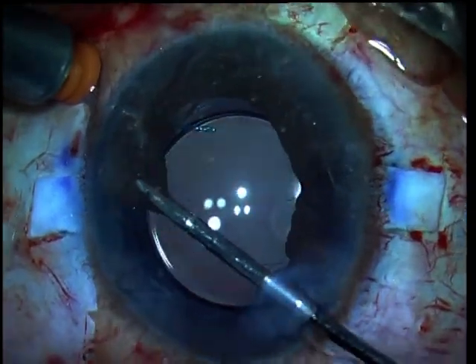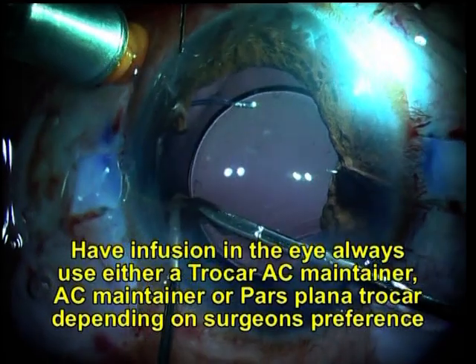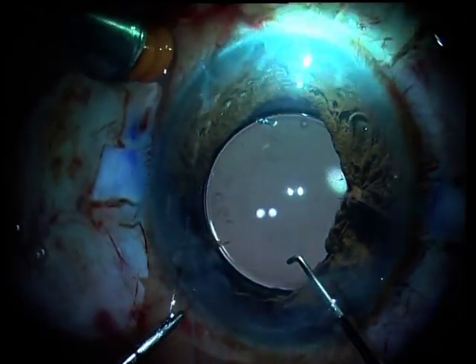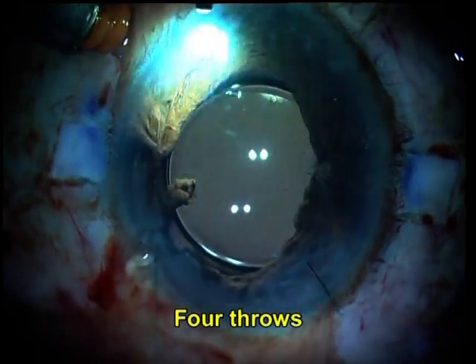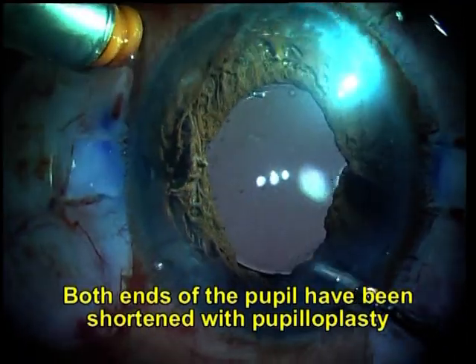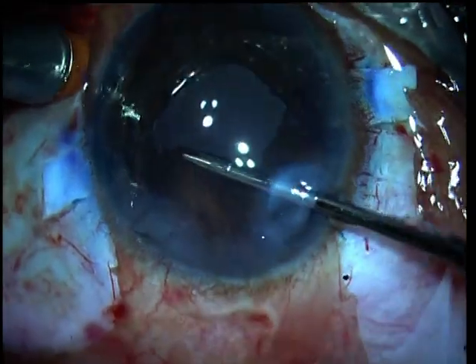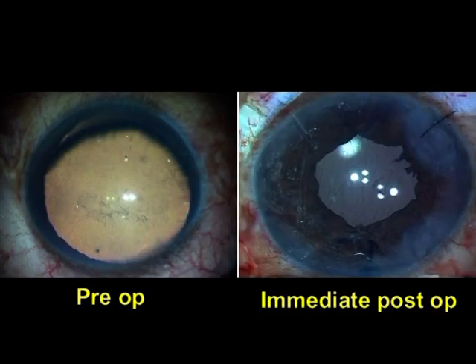The same thing is going to be done on the other end. You will notice we are using an endo-illuminator all the time for visualization. From the other end also, a loop is created, then 4 throws made, and the two ends of the suture pulled. Once you have got the pupilloplasty done, you can make the pupil more round by just tugging on the iris to see how round the pupil is. Air is put and you can see pre and post-op.